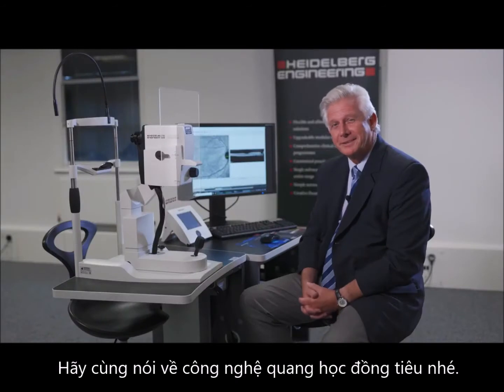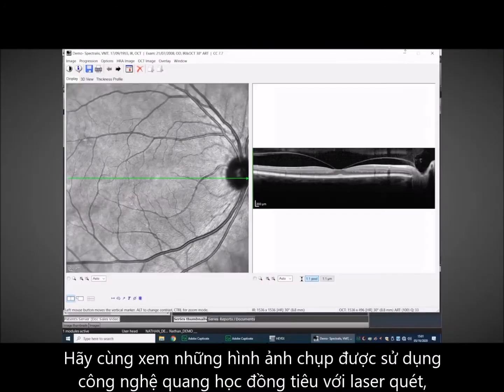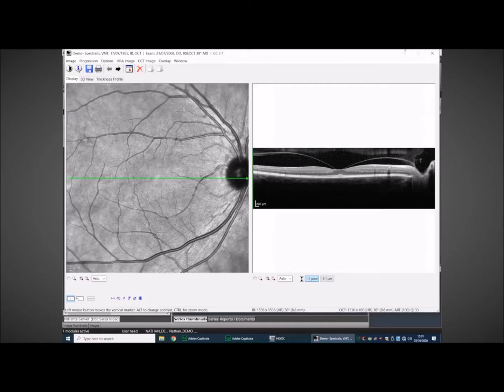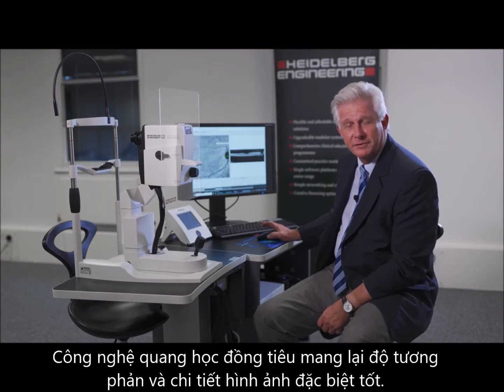So let's talk about confocal optics. Unbeknownst to you, there's a very special advantage that you have just in the optics of the camera of your SPECTRALIS. So let's look at the image that we can get using confocal optics with our scanning laser. You can see that this is an infrared reflectance image, and confocal optics gives you specially enhanced contrast and detail.